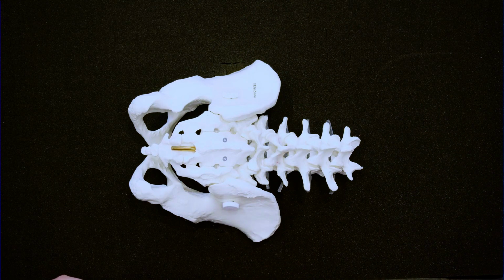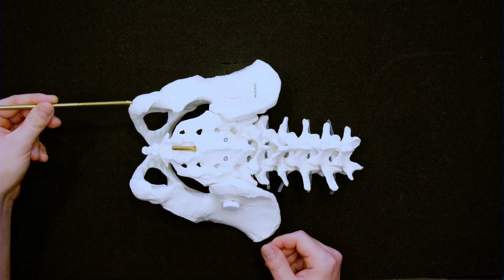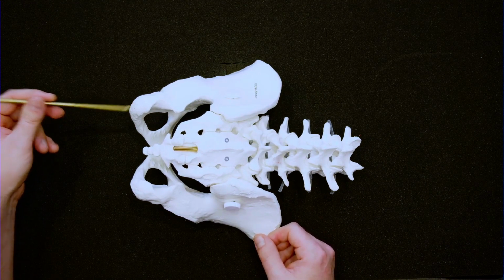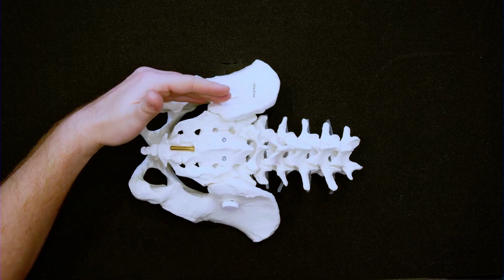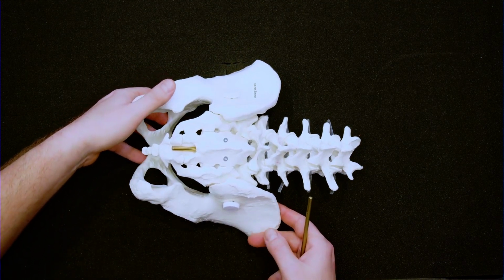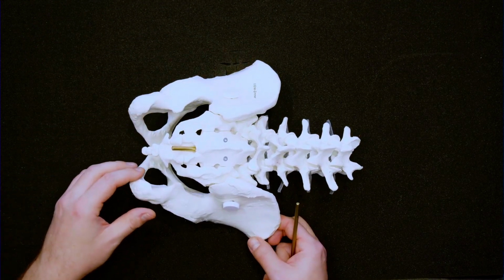Additionally, it's very helpful if you want to address the posterior column, because now you can incise at the ischial tuberosity and place your posterior column screw there. You can do this on one side or on both sides in the prone position. If you have an addition just for one side, it's easy to do this in a lateral decubitus position.